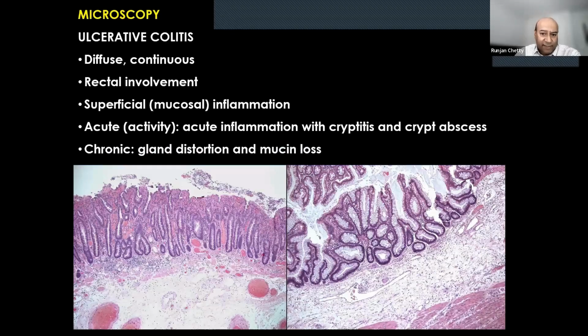Ulcerative colitis, on the other hand, again needs a resection specimen to see the full extent of the lesion. Here you can see there is submucosal sparing and the ulceration and inflammation is up in the mucosa, so it's a superficial inflammatory process. That's active, as you can see, with exudate and ulceration of the surface mucosa. And here's a more healed example, and again there is no restoration to normal. You've got misshapen crypts and glands.